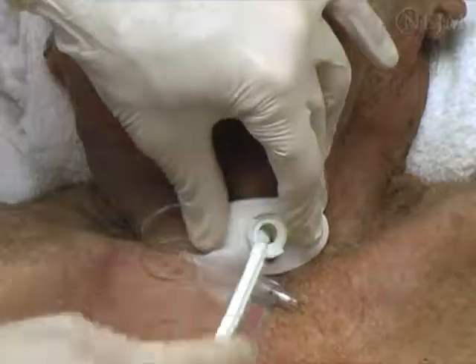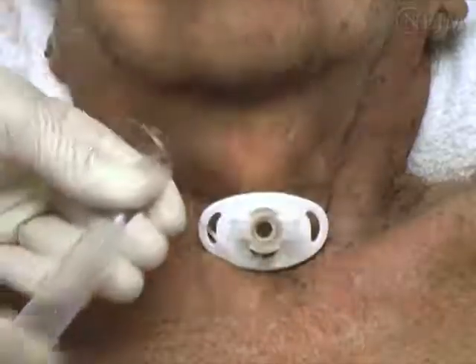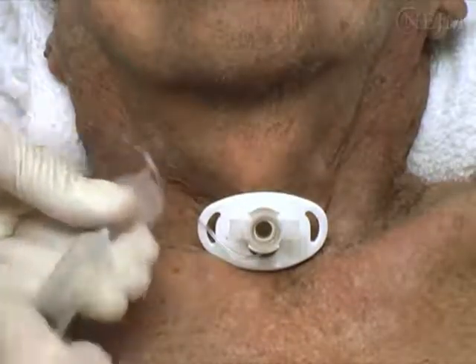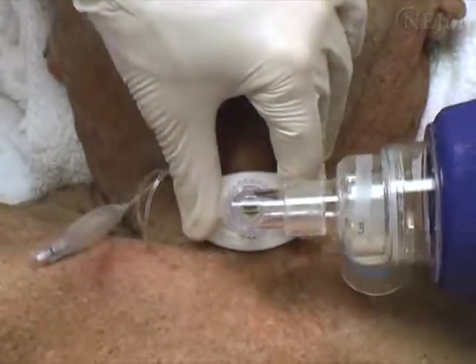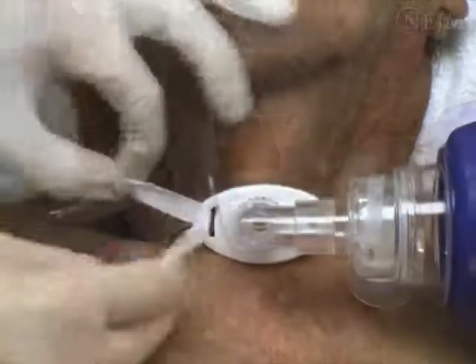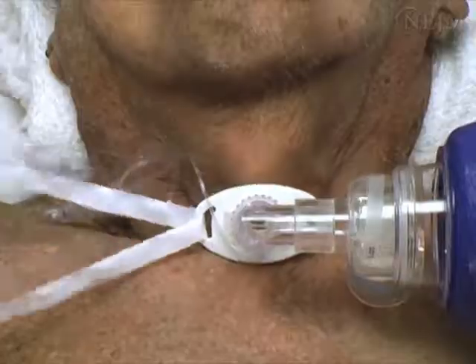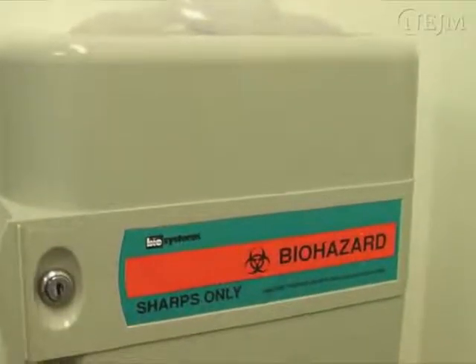Hold the cannula in place, remove the obturator, and attach the adapter. Inflate the cuff with a 10 cc syringe. Attach a bag valve unit and ventilate the patient. Look for symmetric chest rise and auscultate for symmetric breath sounds. Tie or suture the tracheostomy tube in place. Dispose of needles and sharps in the appropriate containers.